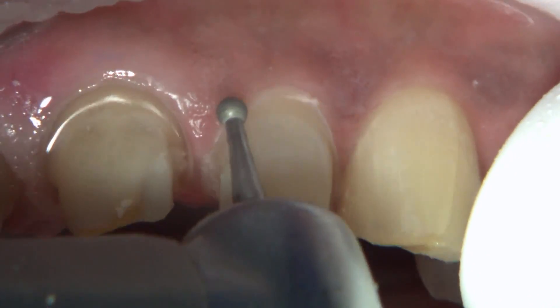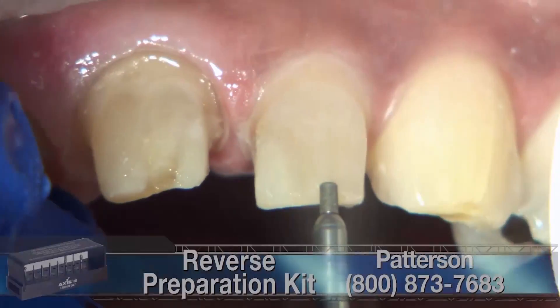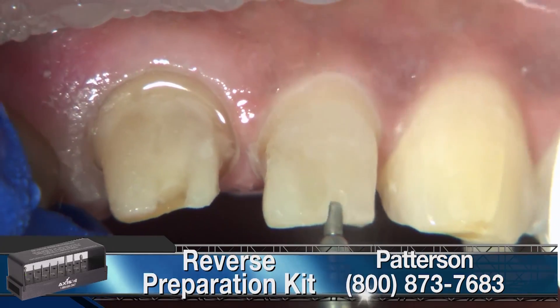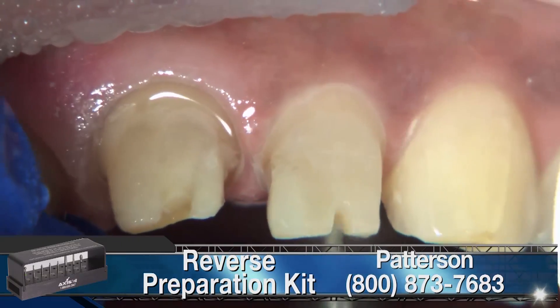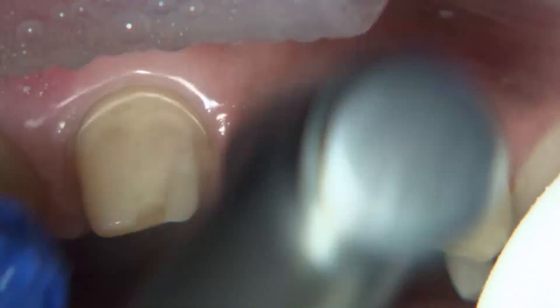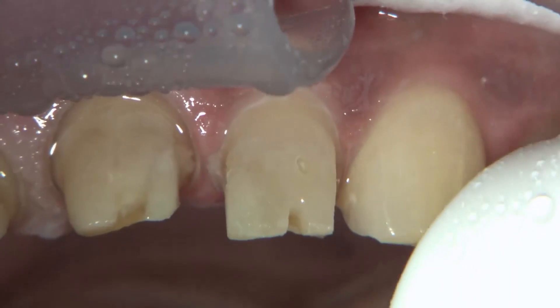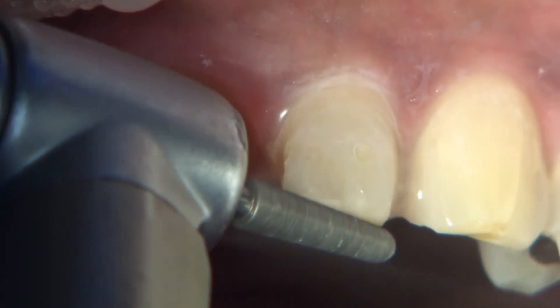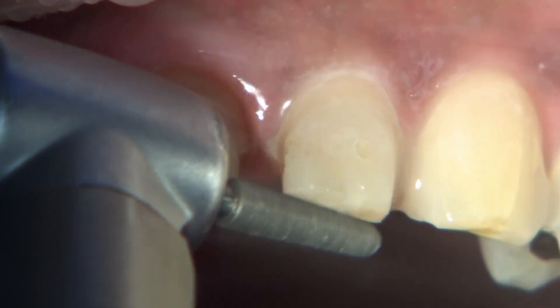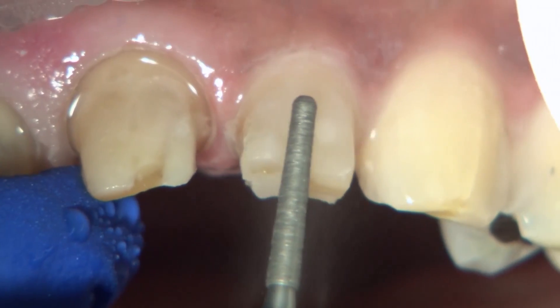This technique, in terms of the crown preparation, is the reverse technique. I like it because it gives you a set of burrs to go through in order to get a final prep. It gives you certain guidelines, so it's very helpful. Clinicians have their own technique, and obviously if you're comfortable with the way you're prepping teeth and you're doing it right, that's based on your comfort level. The reverse prep technique works quite well, and we like it because it's a standardized way of prepping the teeth.